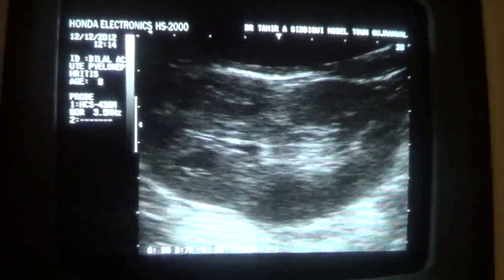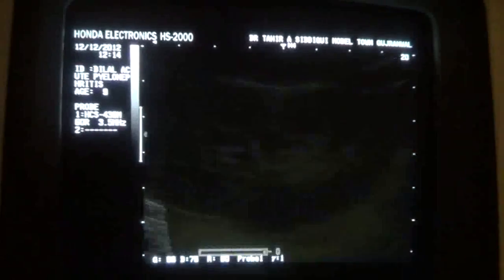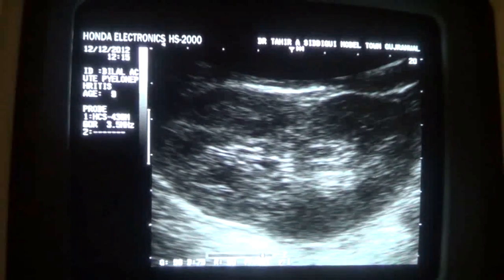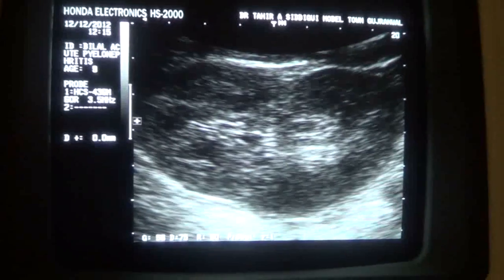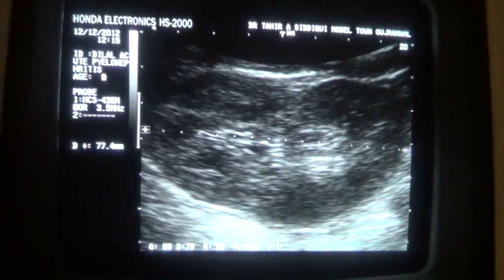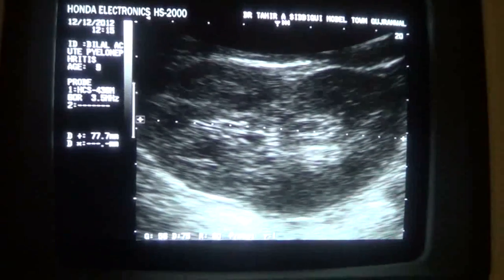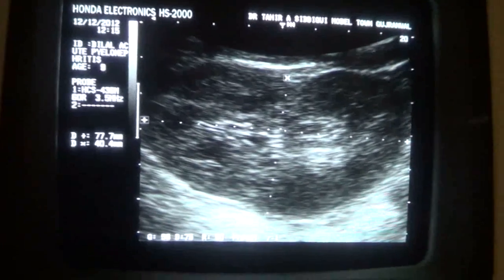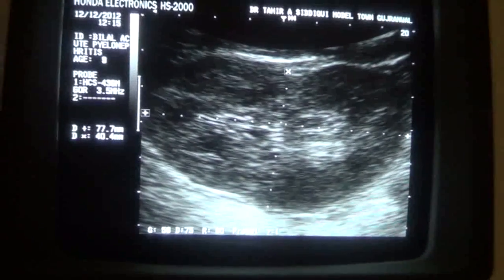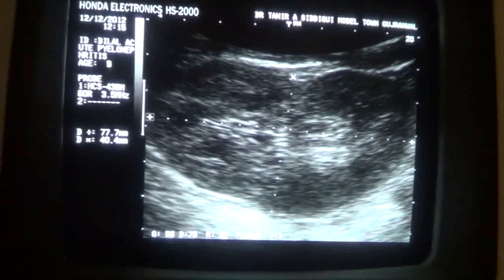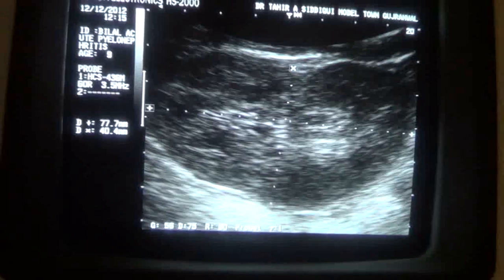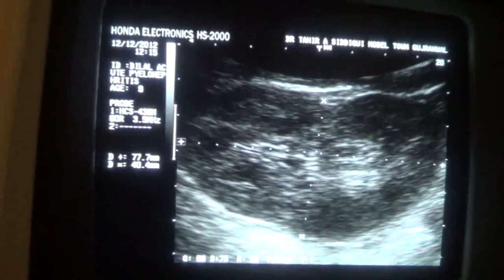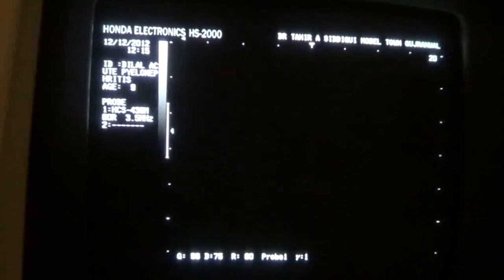This is the right kidney. It measures 7.7 cm in length and 4.0 cm in anterior-posterior diameter. This is normal.